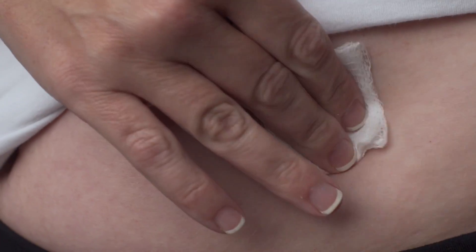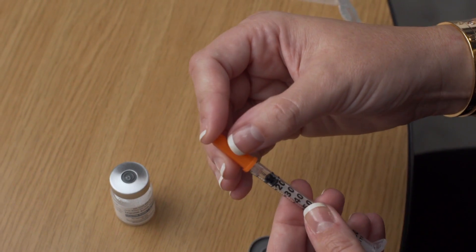Gently withdraw the needle and apply pressure to the injection site with a sterile gauze pad. If necessary, use a band-aid at the injection site. Once your injection is complete, dispose of the used needle and syringe in your safety container. It is important that you carefully follow the dosage and administration instructions provided by your Aspire provider.